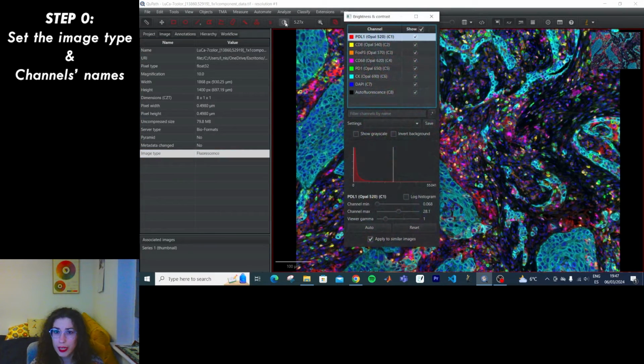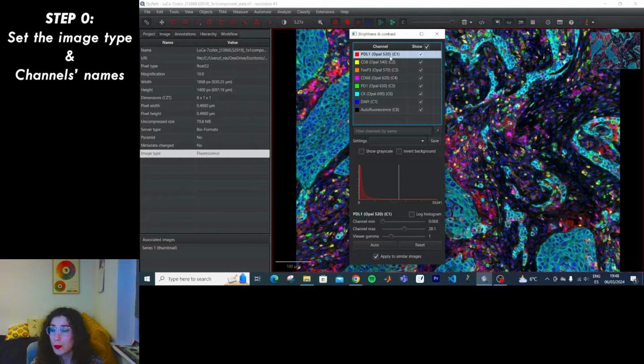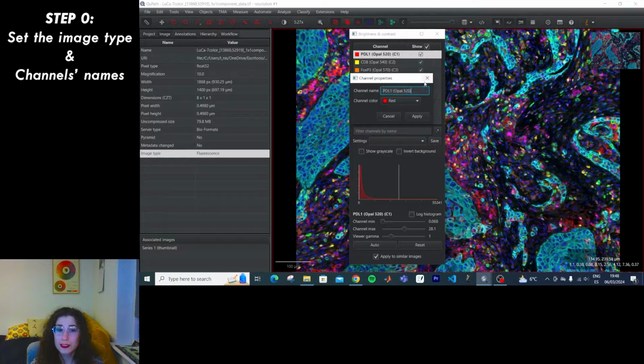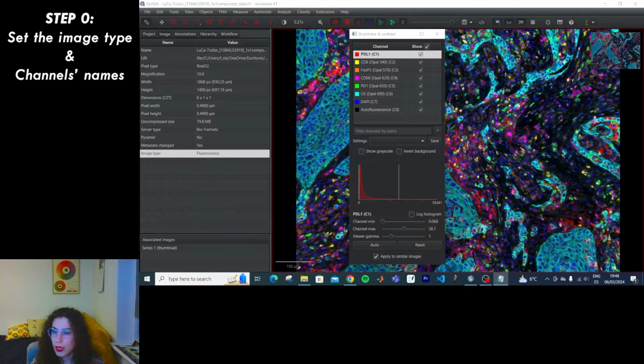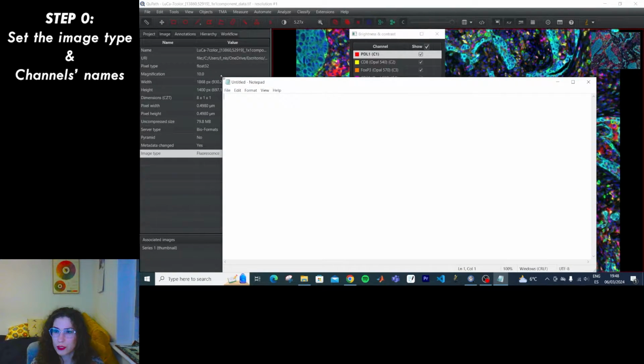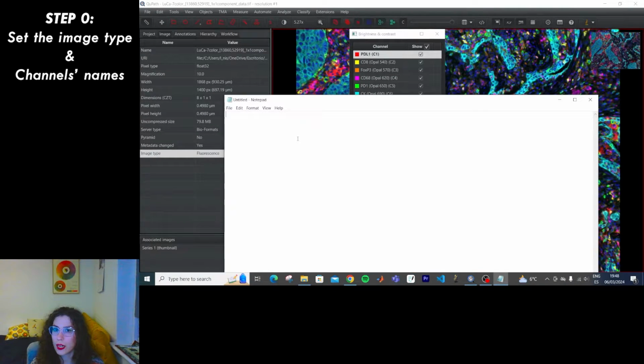Set up the channel names. Okay, channel names are here. And apparently they're too long to be practical, so it's advised that we change them. How? So to me, it just feels easier to double click and delete this for all of them. But apparently that's not the right way, and the right way should be to create with a script editor or notepad or something to write the name that you want.